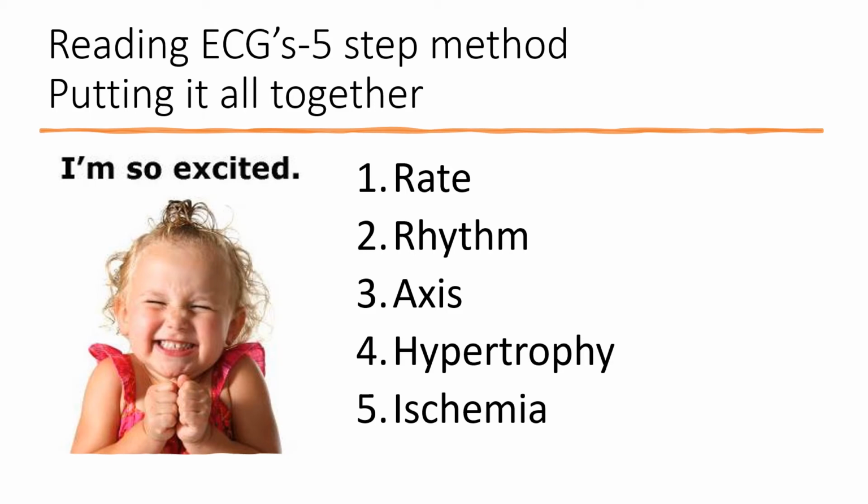The goal is not necessarily to be able to interpret everything, but to be objectively able to identify specific parts of an ECG, and later we can put it all together.